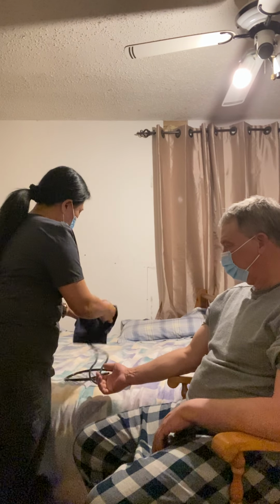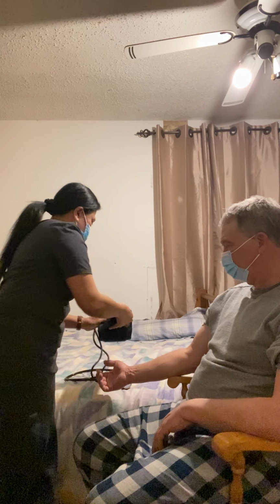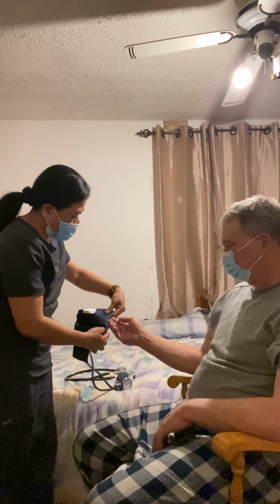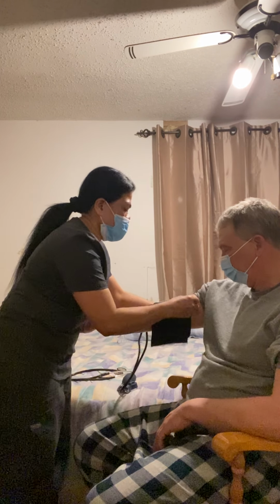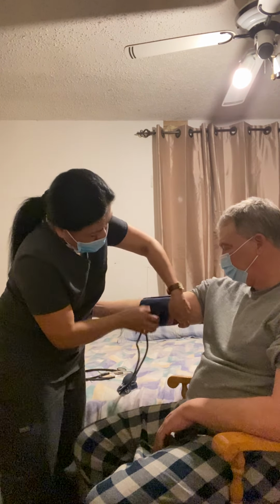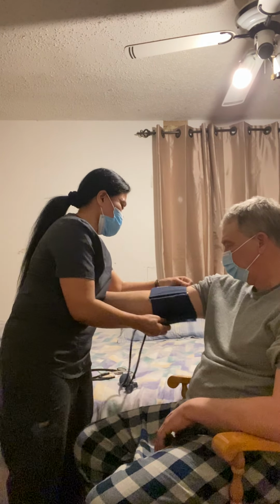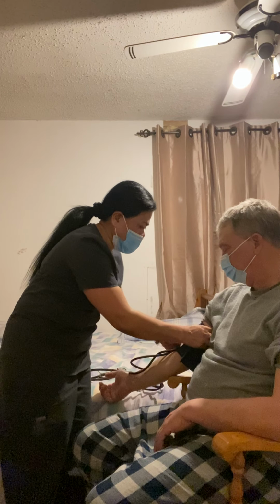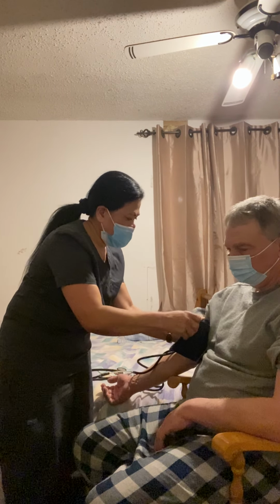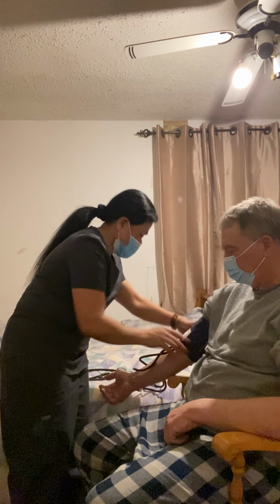Make sure that the arrow is pointing to the brachial artery. And then we also make sure that we have the right cuff for the patient, because if it's too big or too small, it's going to alter our findings. And then just relax. Like that.